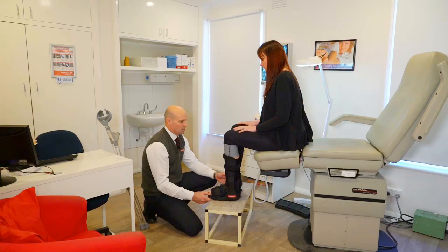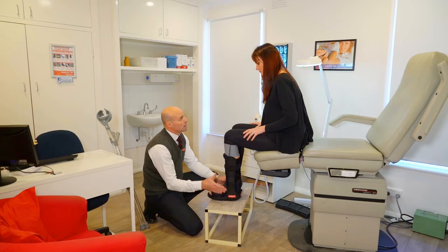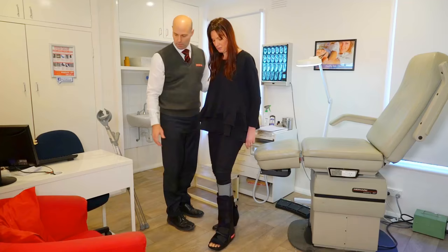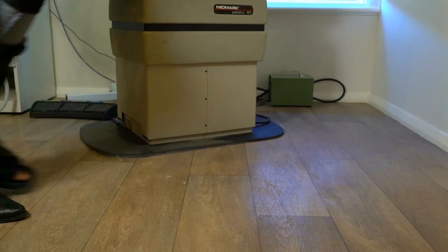Now that the CAM walker is customized and fitted for you, and you've got a supportive shoe on the other foot of equal heel height, we're going to get you to stand up and take a few steps. Lift your feet up gently — I'll slide this out — carefully stand up and just start putting a little bit of weight through it. Does it feel okay? Can you feel that rocker sole? So now there's no more need for the crutches — carefully take a few steps and see how you feel.